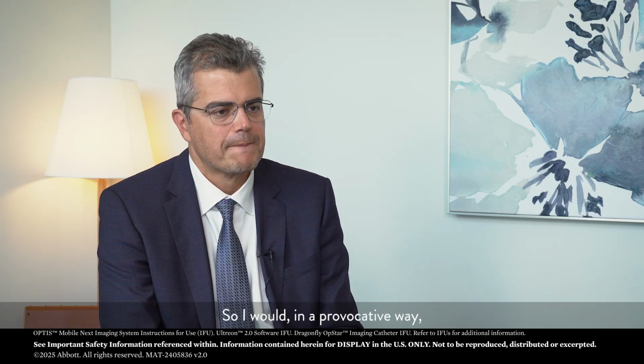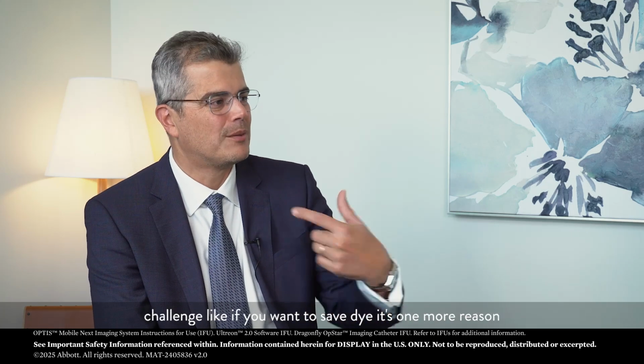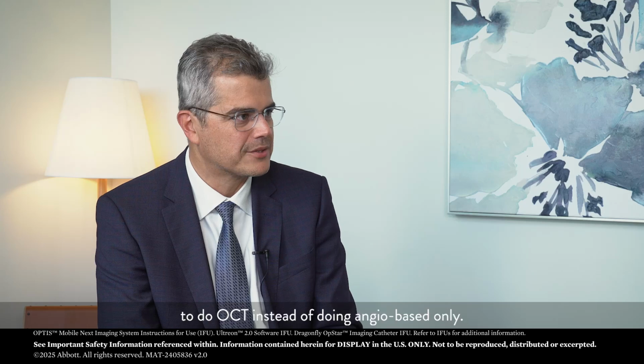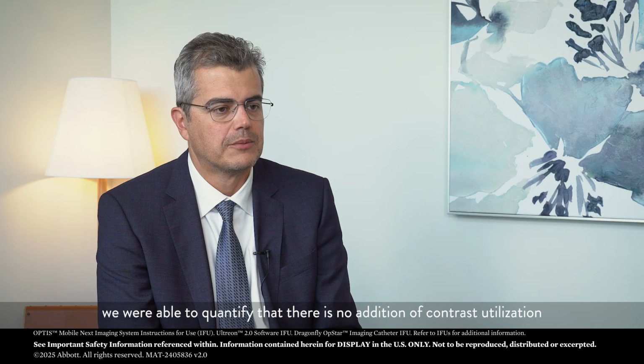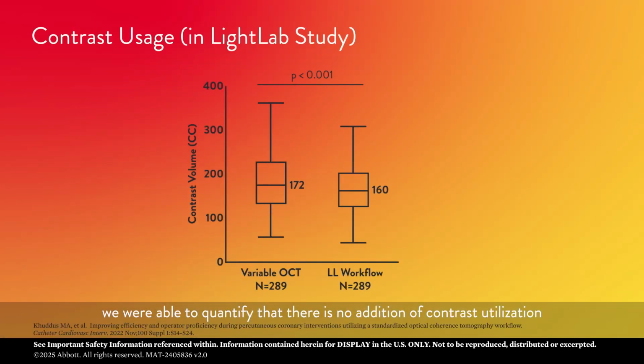So I would, in a provocative way, challenge: if you want to save dye, that is one more reason to do OCT instead of doing angio-based only. Recently, through the LightLab initiative, we were able to quantify that there is no addition of contrast utilization when you do PCI guided by OCT. And in some cases, you really can save dye.